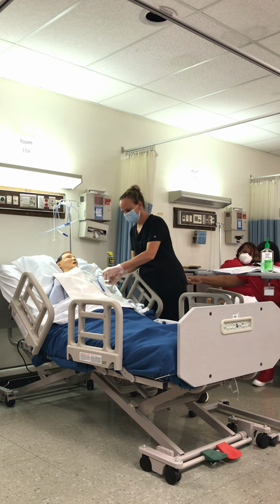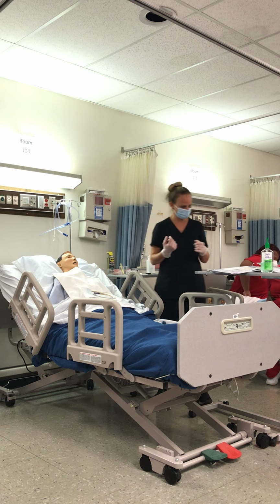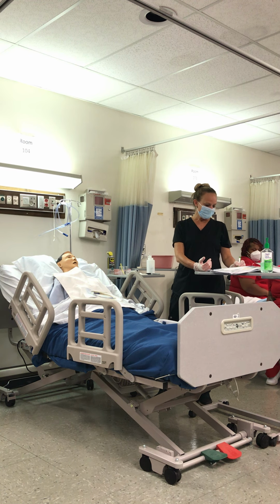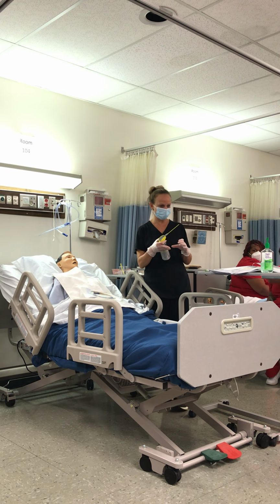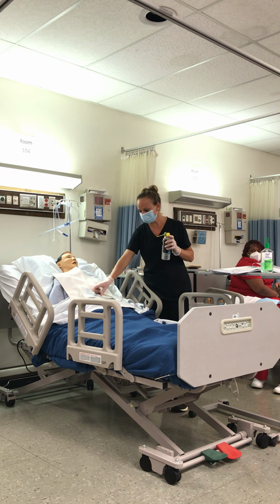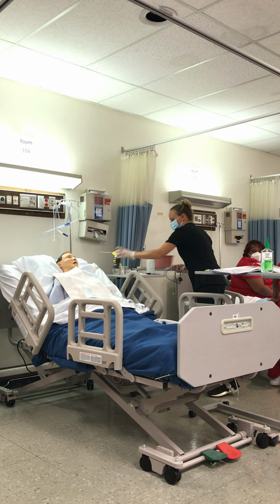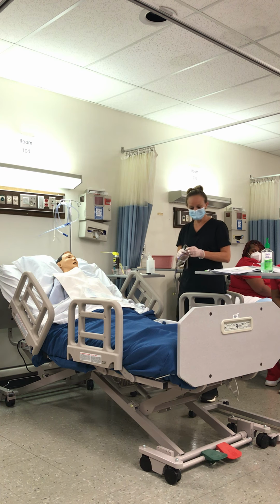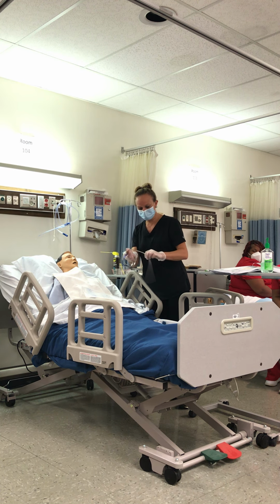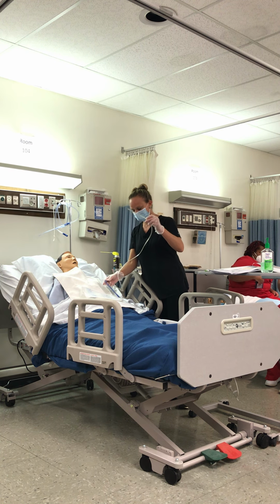Alright. This again is where I want to make sure I don't just put this tube everywhere. I want to try to keep it as clean as I can because sterile is out of the question, right? A lot of times what you'll have is a 4x4 and maybe a little lubricating jelly. They told me because these are really hard to pass, they've always put WD-40 on them. If y'all decide to use that, it needs to be over the trash can like I just did, okay? Do we want this gunked up on there? No. We just want it kind of damp, okay?